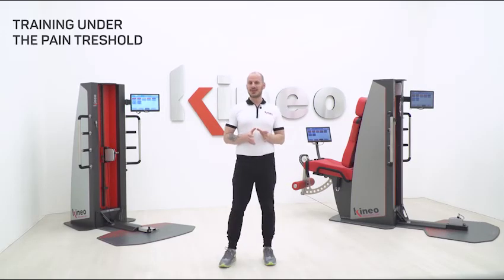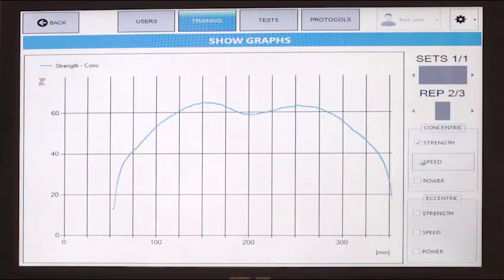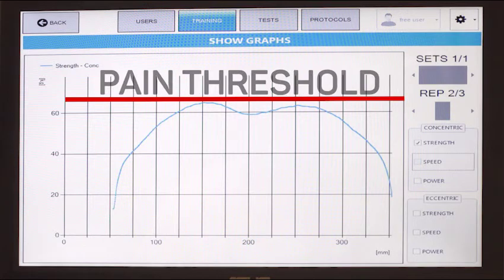The Smart Viscous Method is considered ideal for painful pathologies, because the load adapts automatically while staying always under the pain threshold.